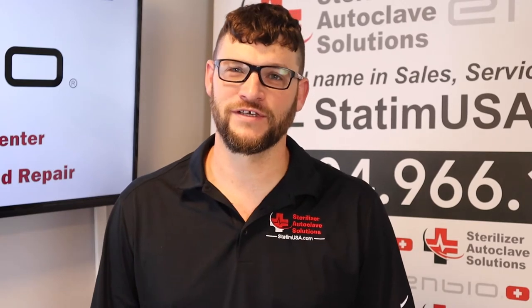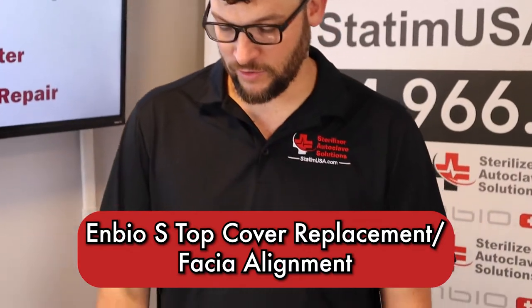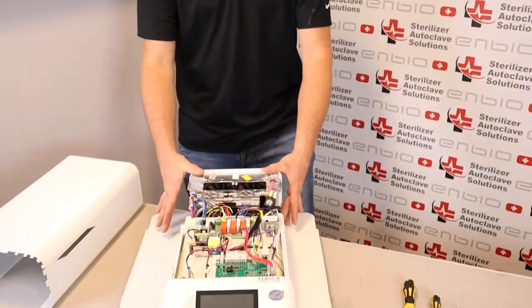Hi, this is Ian with Sterilizer Autoclave Solutions, your U.S. authorized warranty and service center for your Enbio S. Today we are putting the top cover back onto our Enbio S. This can be a tricky procedure.